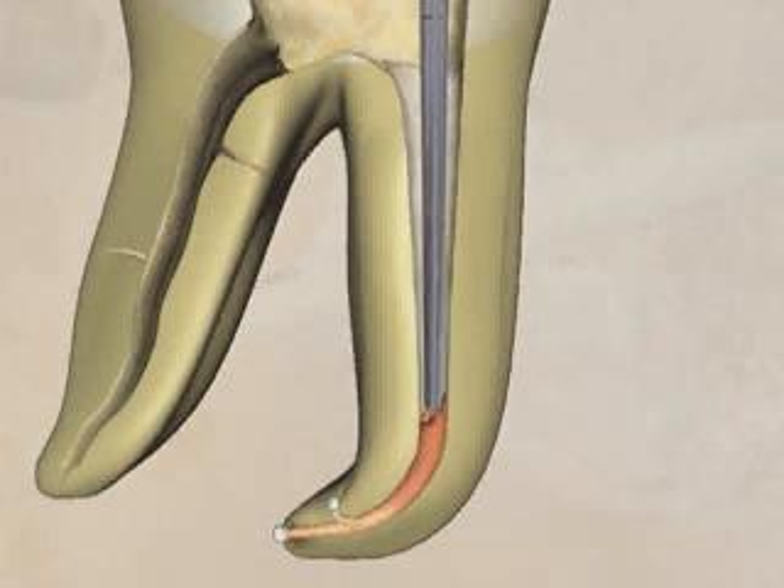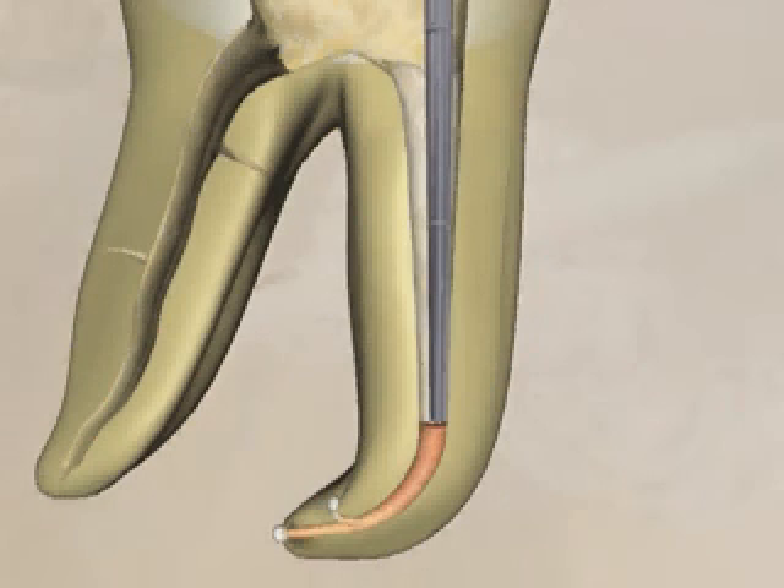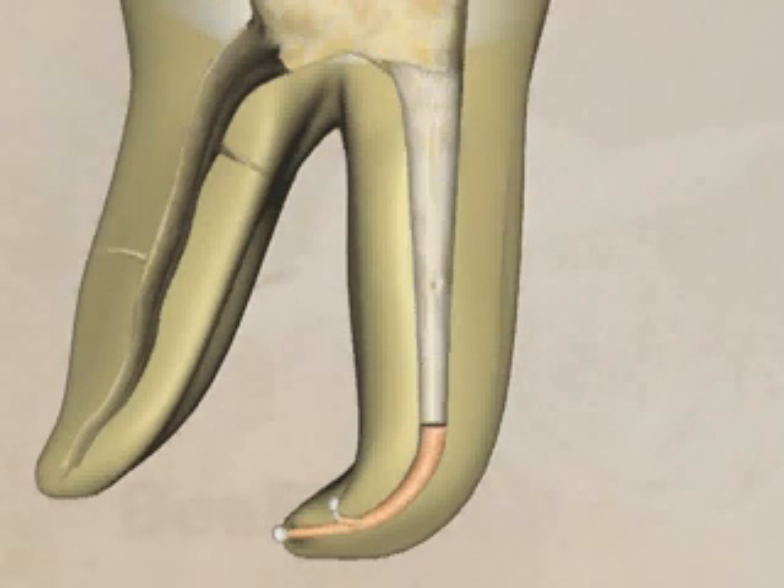A small pre-fit plugger is inserted into the canal space and used to tamp down the apical plug of gutta-percha. The plugger is then removed in the final step of the continuous wave technique, leaving the apical plug and the remaining space ready for backfilling.